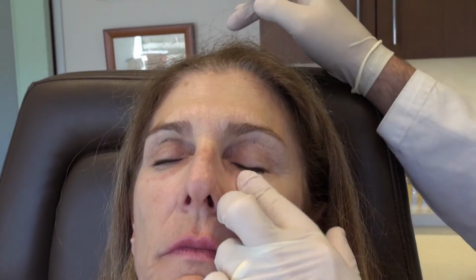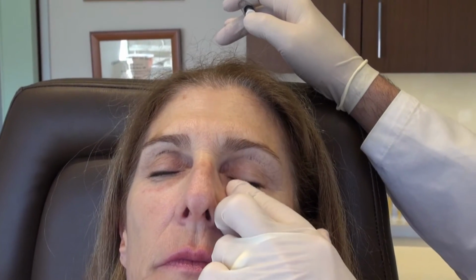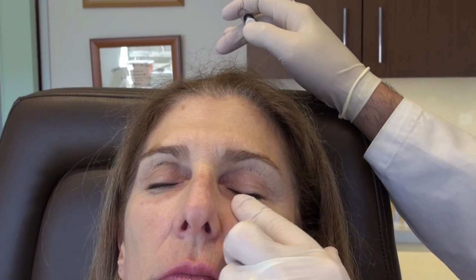And you see how nicely it molds. It really contours well into that indentation of the tear trough. So far I've used 1 cc of dilute Juvederm, so I've used half a cc of Juvederm and have combined with half a cc of saline plus 0.15 of lidocaine with epinephrine.